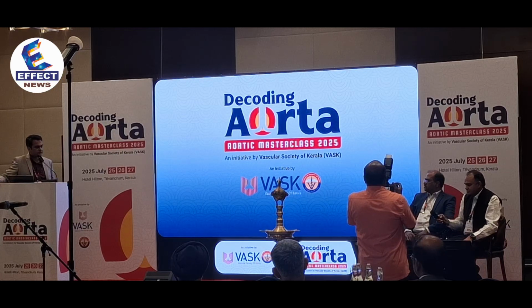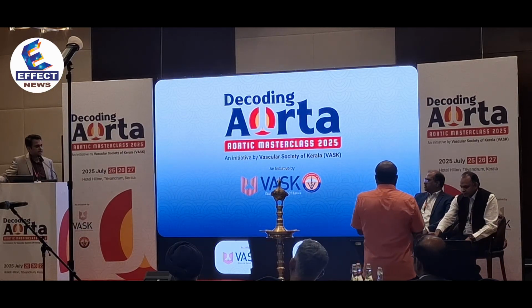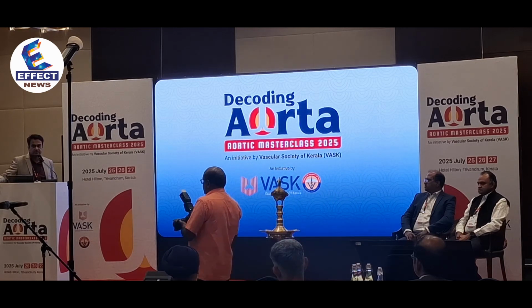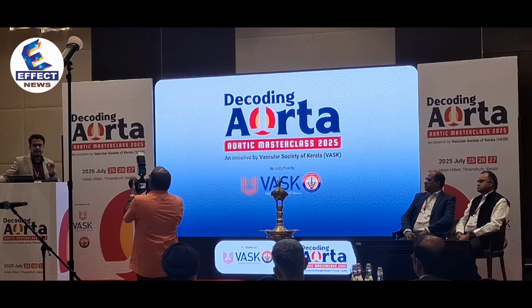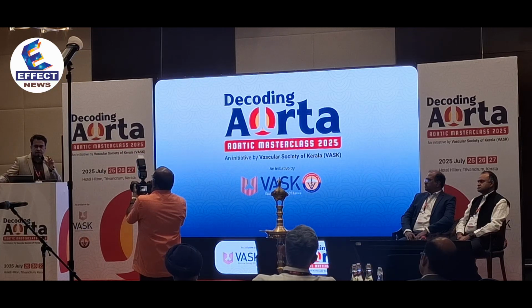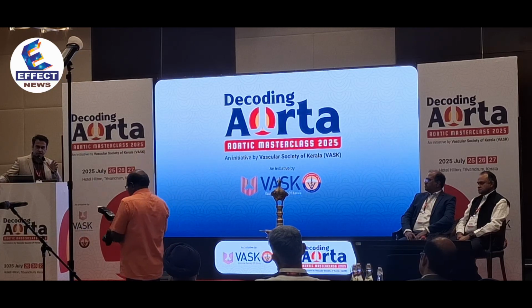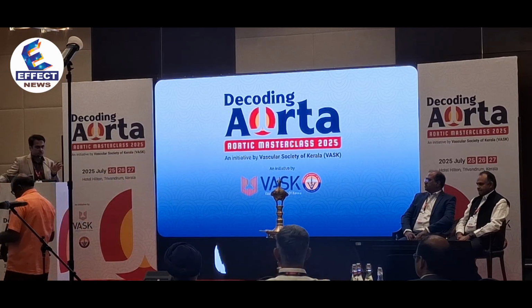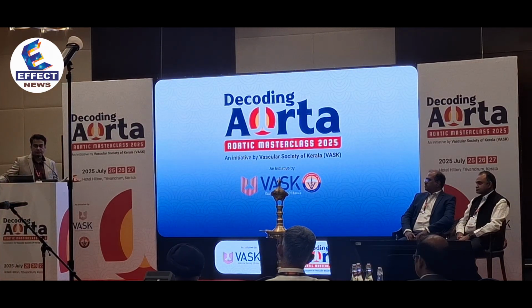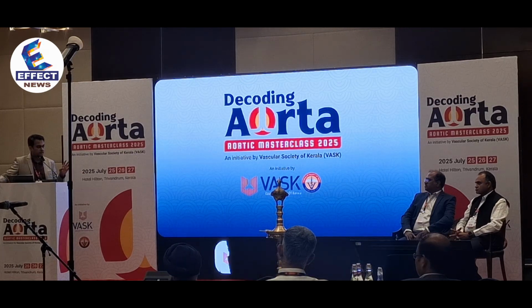Right. So nice question, Safi. So number one, plain CT is absolutely good enough actually for doing measurements, because in open surgery you are not, like in endo, so much concerned about accuracy of the sizing. You just need to have a rough estimate so that you can put a graft that fairly matches the aorta. So plain CT does fairly a good job in a CKD patient, or even if a patient is coming with a ruptured aneurysm and you don't want to waste time doing a contrast. A plain CT does perfectly fine. So that's question number one.